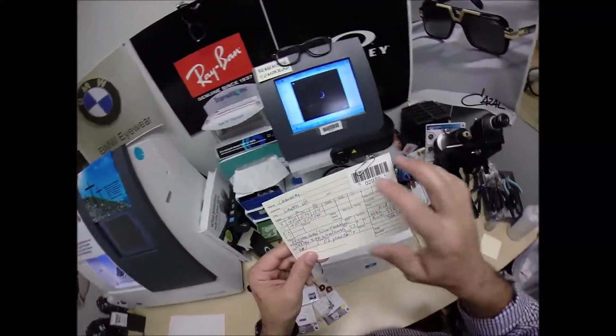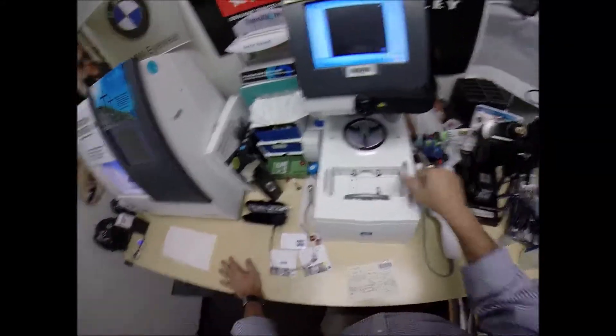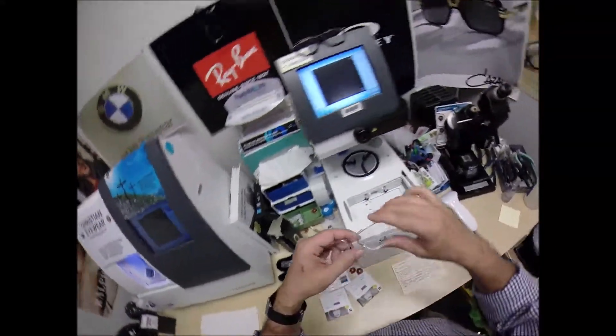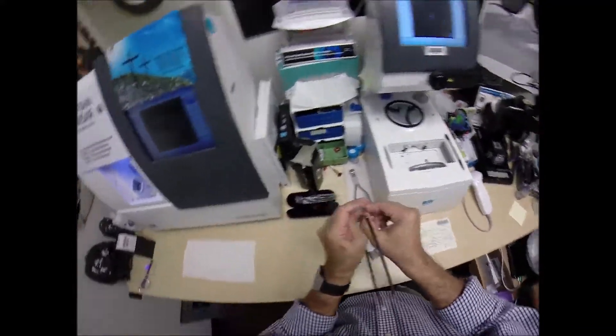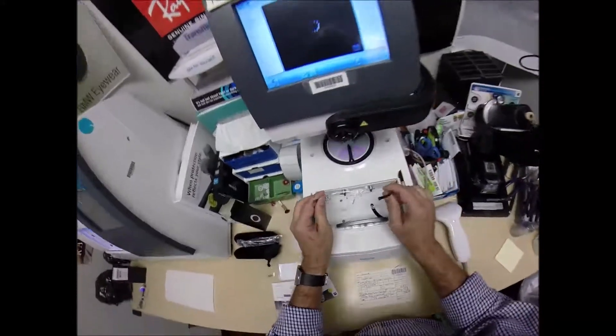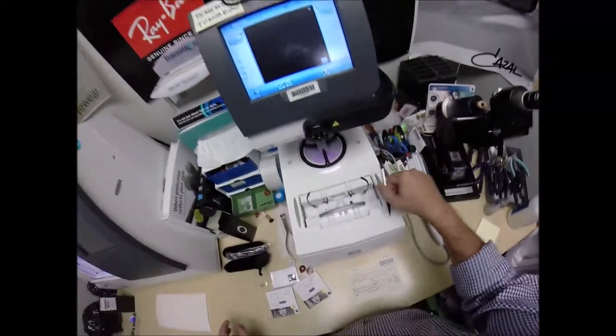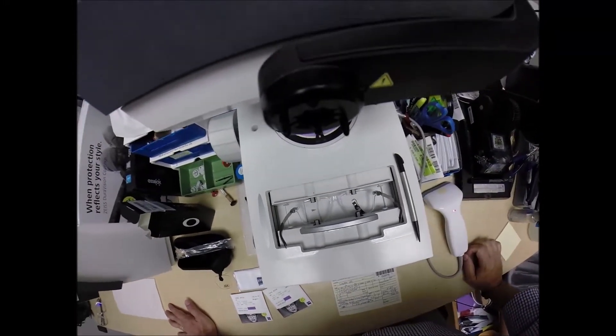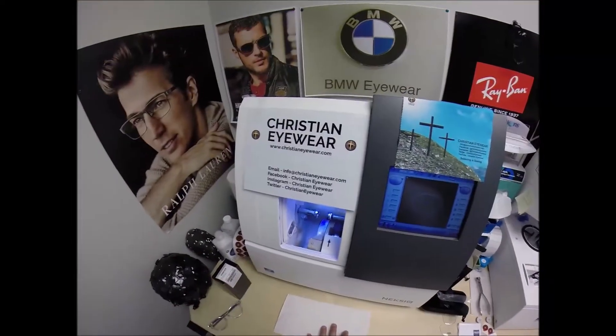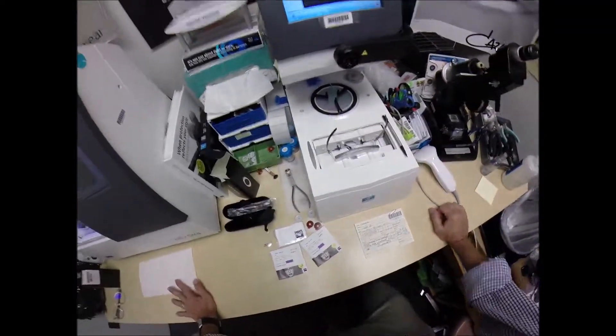I'm going to program the shape into the computer so that years from now, should you ever need new lenses, I can send them right to your home. I hit the start button, the little stylus is going to pop up, go around, trace the inside bevel of the right side of the frame before doing the same thing on the left side.